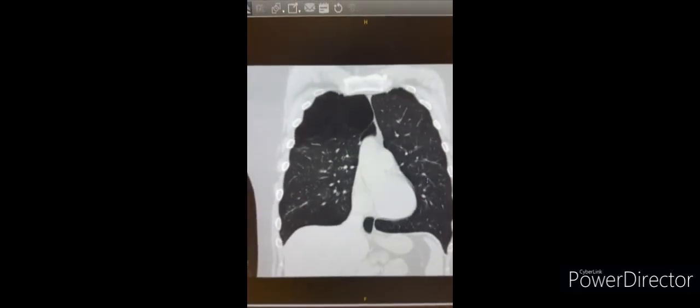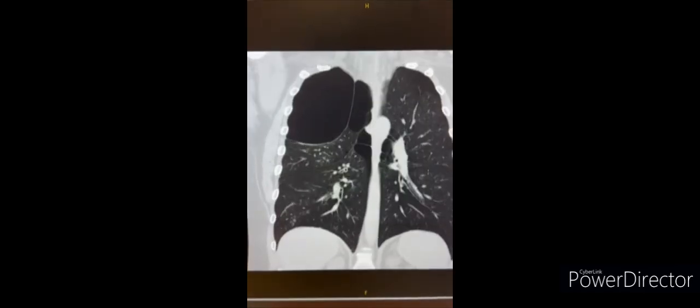I'd like to share with you the step-by-step approach for a uniportal large bullectomy. This is a 40-year-old male, morbidly obese, around 39 in BMI, who's a smoker as well as having bronchial asthma. He's been having on and off dyspnea, which he attributed to his obesity. Recently, he was admitted as a case of exacerbation of his bronchial asthma.